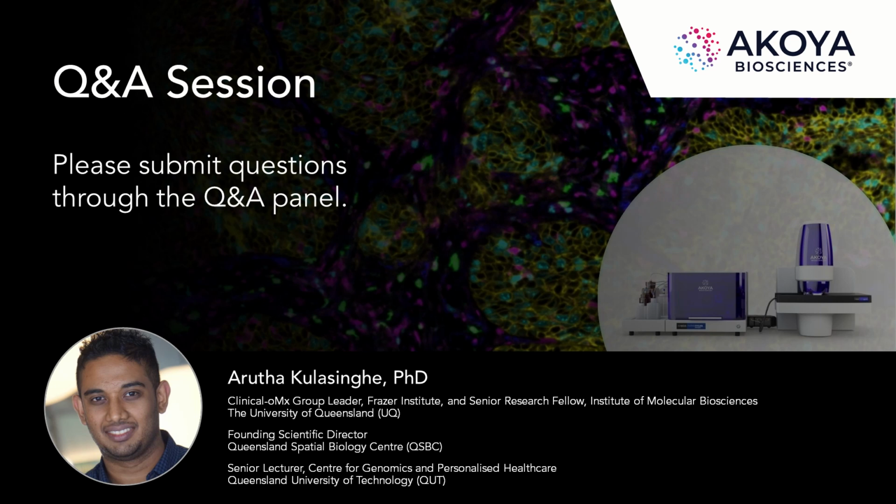I think that leads well into another question here. Somebody's written that they're new to the field, and there's obviously a lot of tools on the market. So how do you decide on the technology and approach? Yeah, it's a good question. I think the first question you need to ask yourself is, do you need spatial to answer the question you're asking? I think a lot of people are jumping into spatial without having a spatially relevant question. If that's a yes, then trying to figure out whether it's discovery or translational.